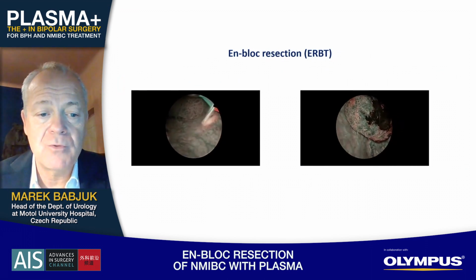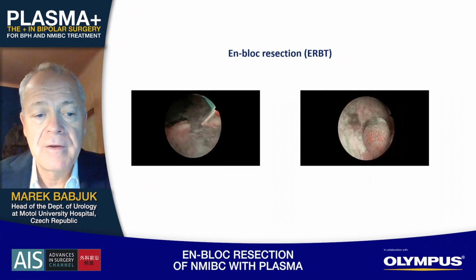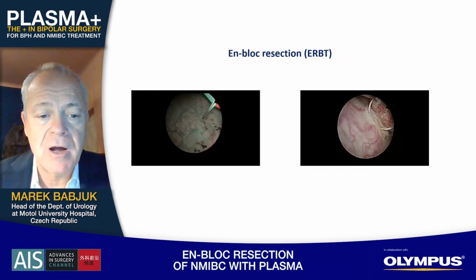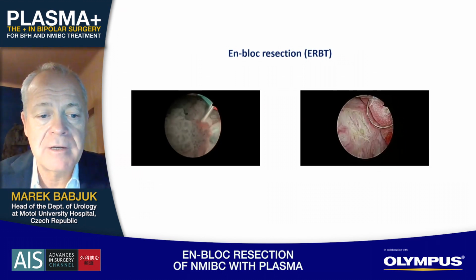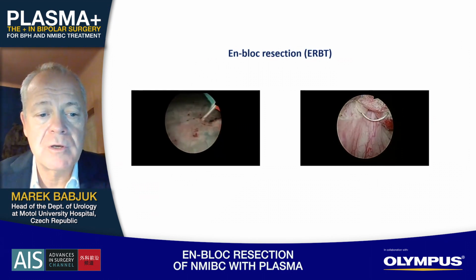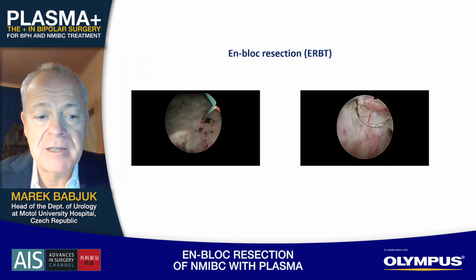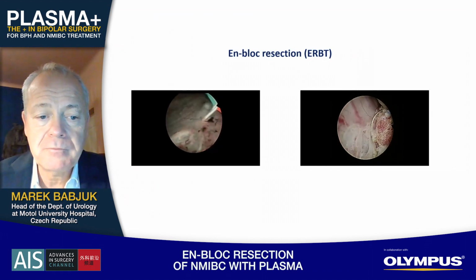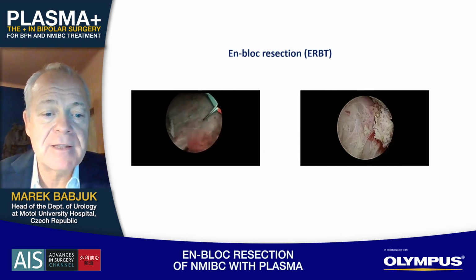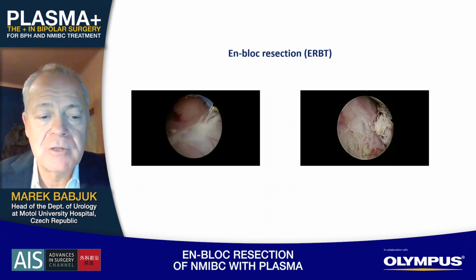On the left side of the video, you may see the technique where we are using the incision electrode, the so-called Collins knife. You can use it in tumors which are well accessible, mostly on the base of the bladder, and it is necessary that you can find an approach to the posterior aspect of the tumor. The advantage is a very precise demarcation of the tumor area. Here we are using NBI for visualization of the tumor. The disadvantage is that in patients with, for instance, an obturator kick, it may cause perforation of the bladder.